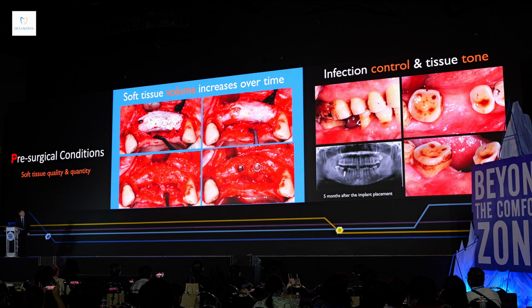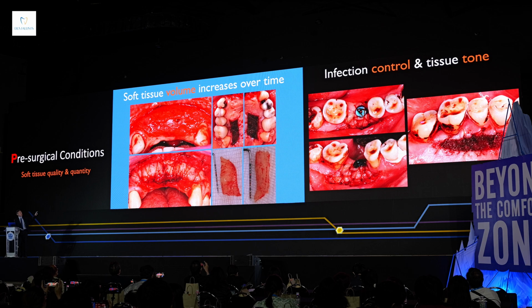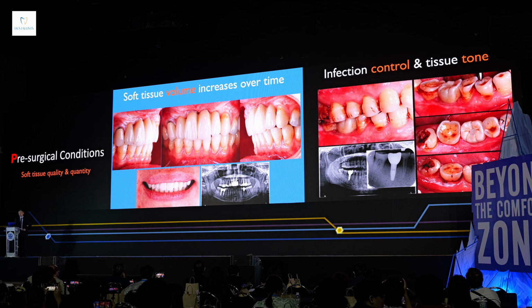And for the middle screen, it's the augmenting. I waited about 18 months. When I opened it up, I saw enough bone had grown all the way across, or even beyond, the tenting screw. That's more than 10 millimeters of bone augmentation, right? And the other side was ready for the soft tissue procedure. On the central screen, I placed 2 implants. On the other side, I did a free graft to correct the soft tissue and gain keratinized tissue. So this is the result.